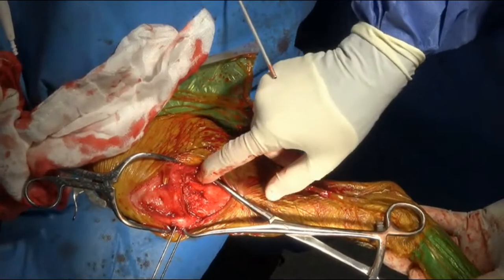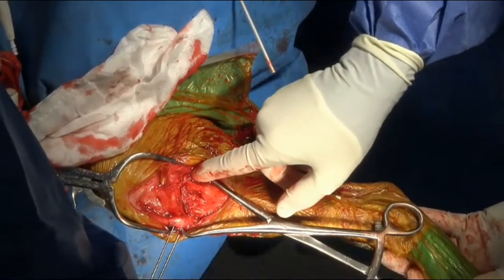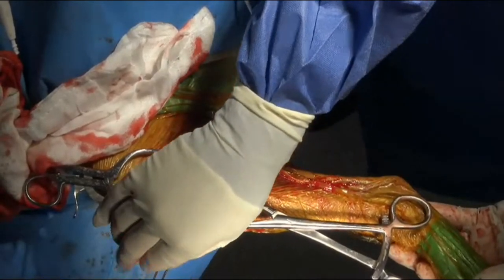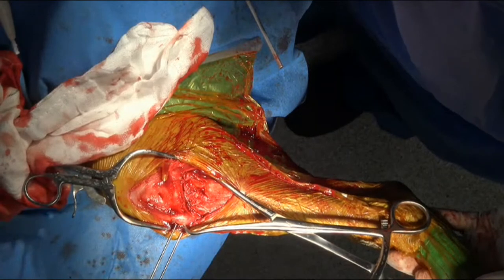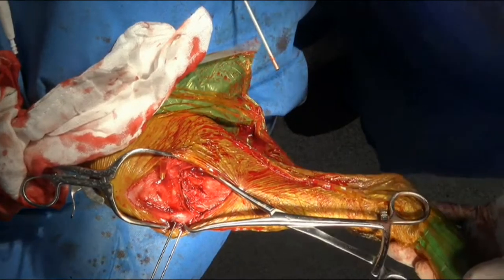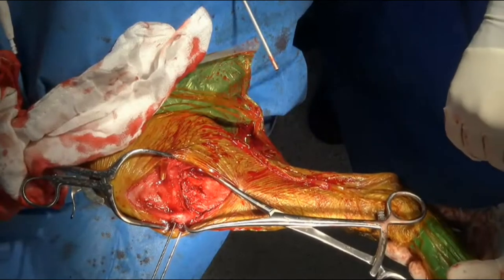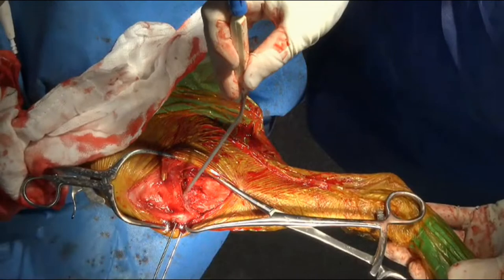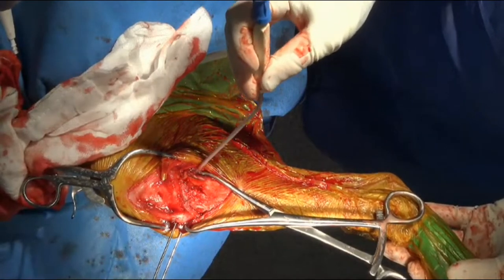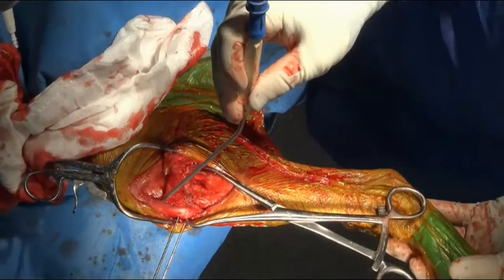The next thing we're going to do is then measure how long we want our headless compression screw to be. So I need a drill guide. I mean a depth gauge. So depth gauge if we get one. Do we get a 3.5 kit yet? Can we get a 3.5 kit, please? I don't think we got the 3.5 kit yet. And then you'll get that one.